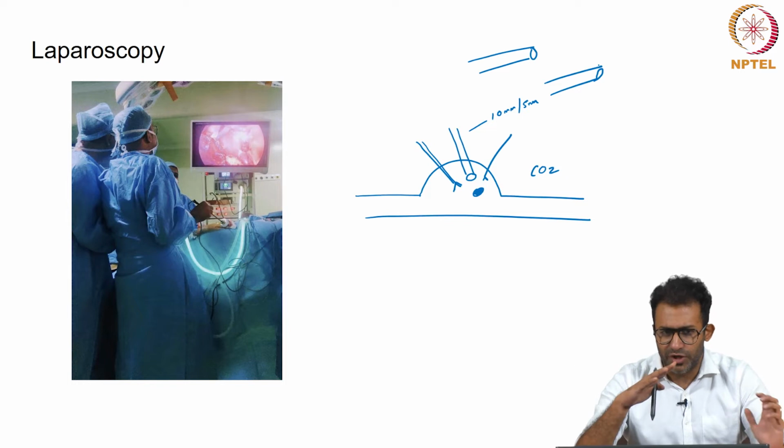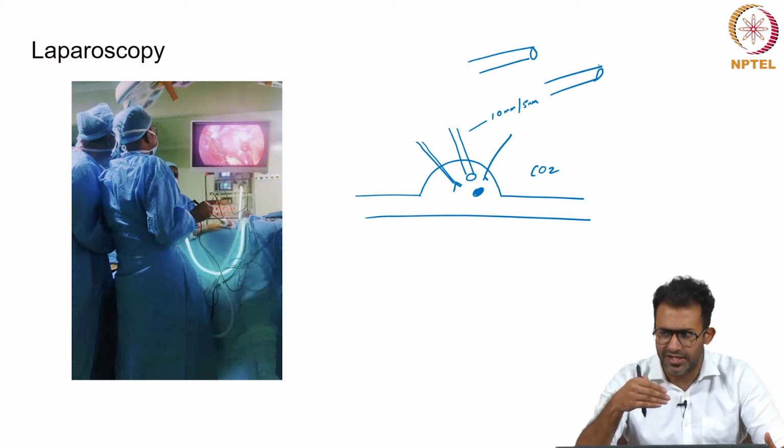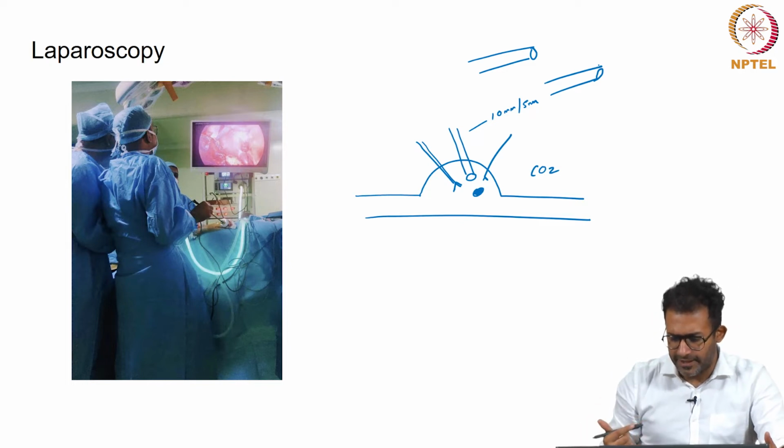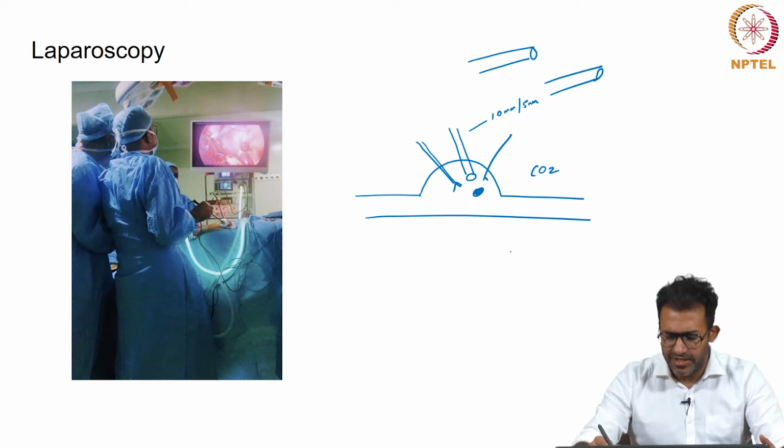So the potential for laparoscopy is immense, and right now we are doing a lot of things through laparoscopy. It requires a huge amount of skill and dedication on the part of the learner to improve his skills in laparoscopy. Some of the basic principles of laparoscopy are as follows.